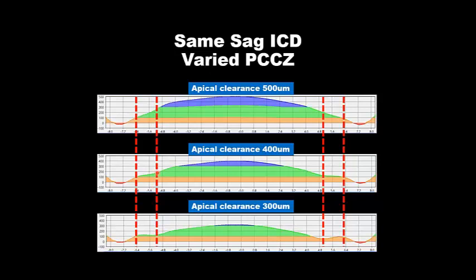Check out this angle here from this red bar to this red bar, and then compare that angle from here to here. Notice how it's gotten much closer to the surface of the eye, 0 being the eye surface. If we were to change that angle and make it higher like we have here, now we make that central optic zone bulge forward, creating more apical clearance.